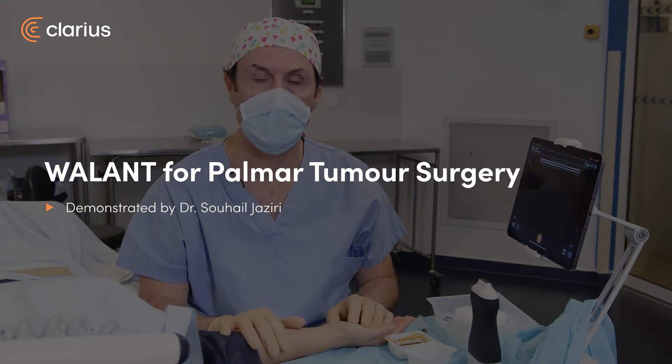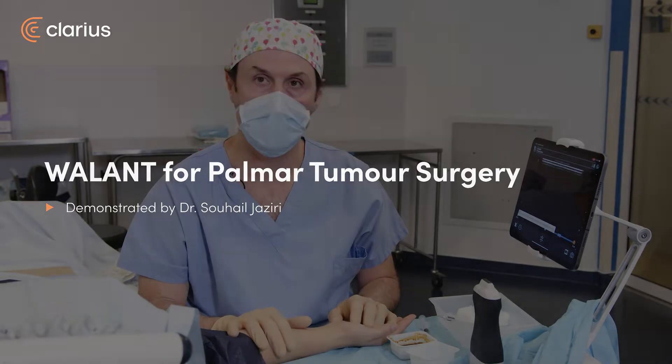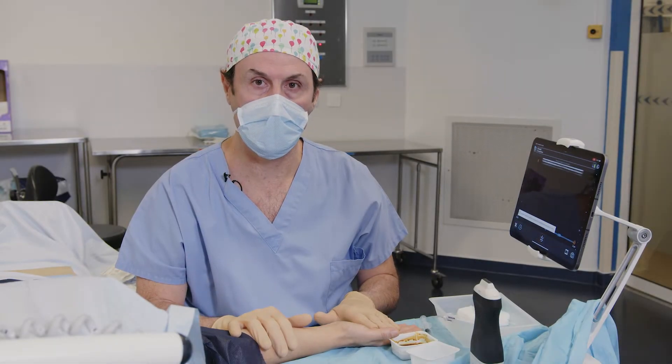Hello, I'm Dr. Jaziri. I'm an anesthesiologist and we will perform today a wide-awake anesthesia for the palmar tumor of the right hand.